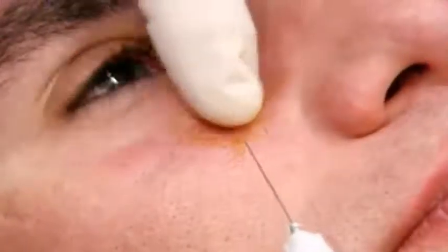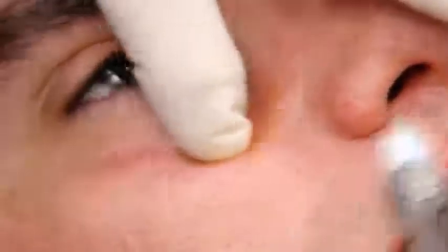After withdrawing the needle, note the wheal and the small bleeding point, which also indicates the site of needle penetration.